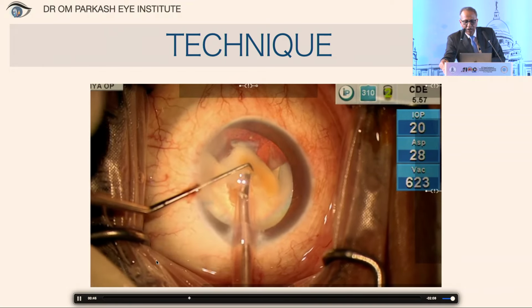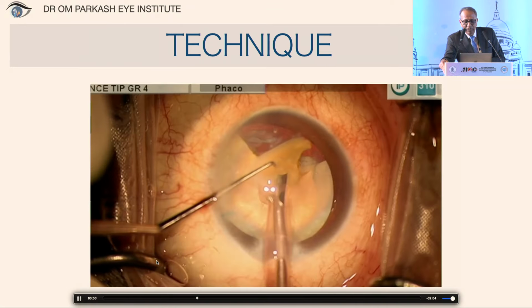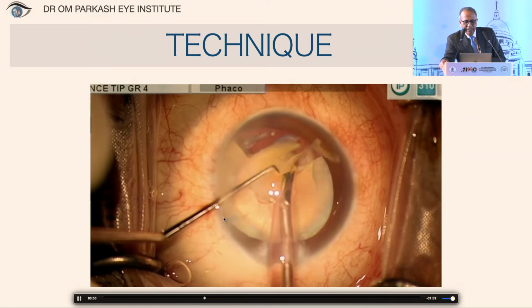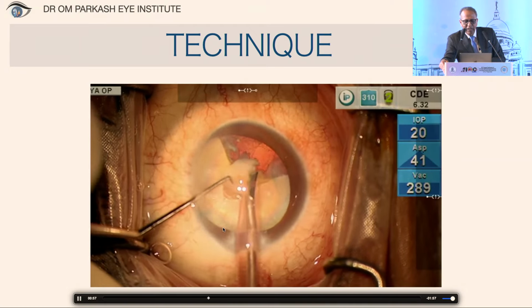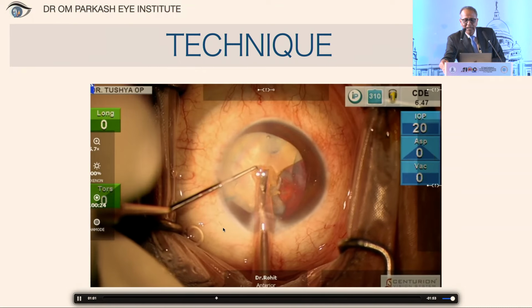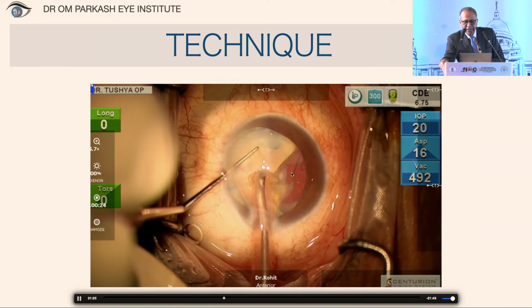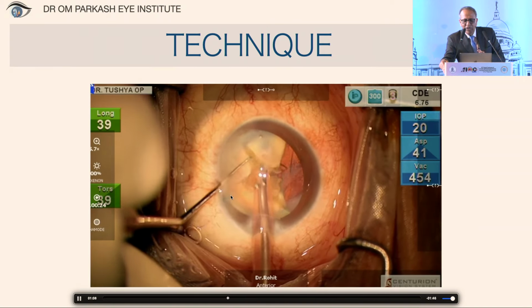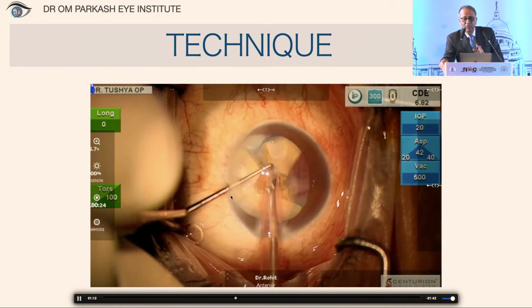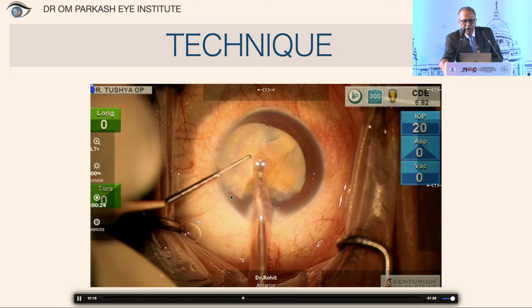So you will see now I am doing a slow motion phacoemulsification, but at the same time you will realize that all these flaps, 1, 2, 3, and I cannot see the fourth one, they flutter in between. So this is reassuring, because at times what happens is that these two flaps are fluttering and out here one of them stops fluttering or both of them stop fluttering. So that may be a sign which we may be missing. So I'm now moving around.